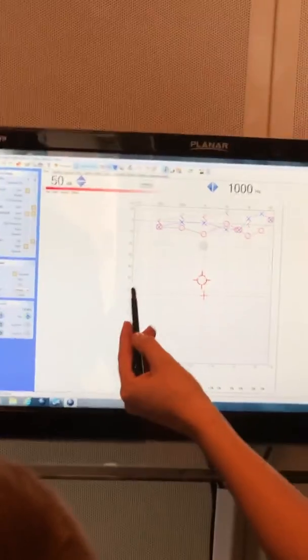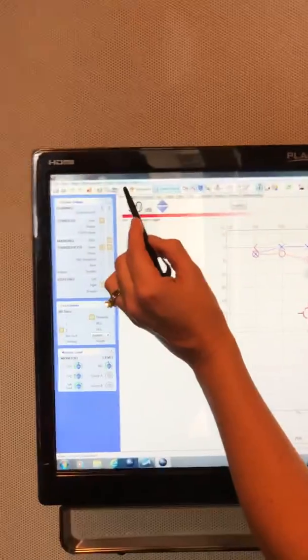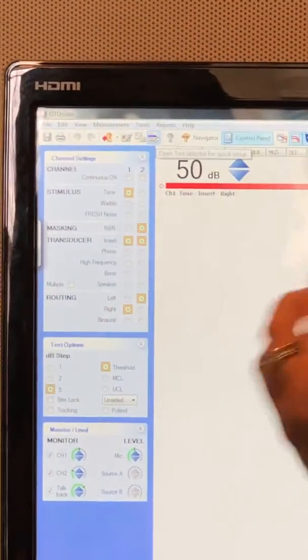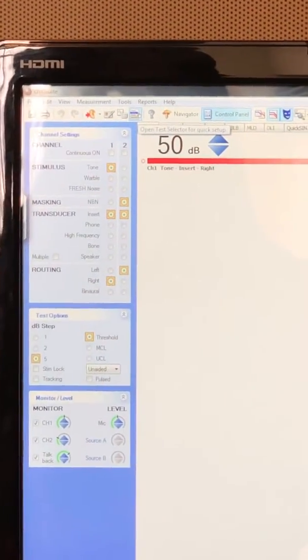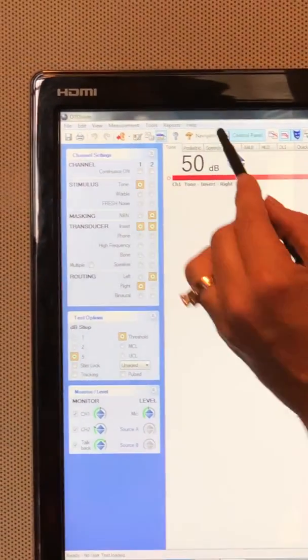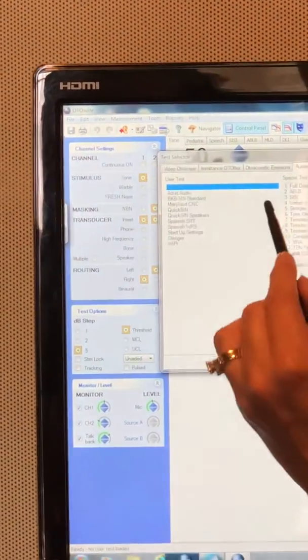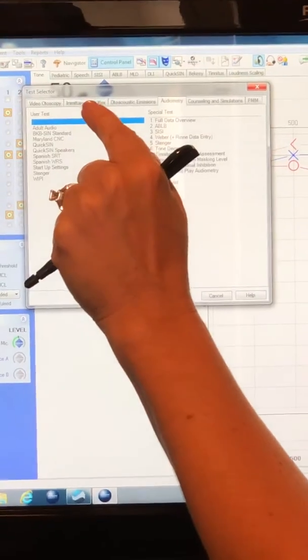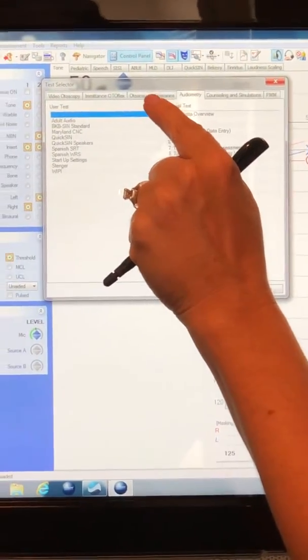Once you're in the file, you go back to the test selector button — this one right here, highlighted in blue. This is the one we switch back and forth between otoscopy and audiometry. Here you see the different tabs: video otoscopy, otoflex, OAEs, and audiometry.